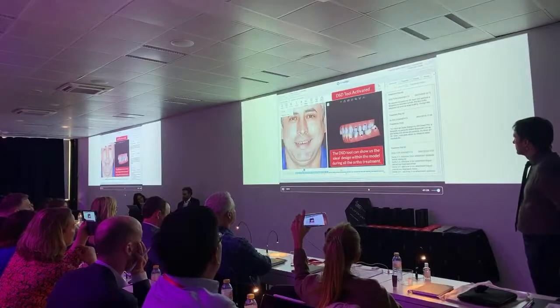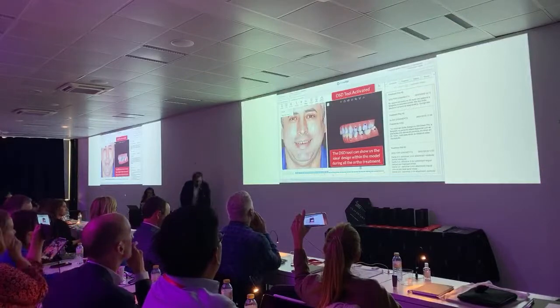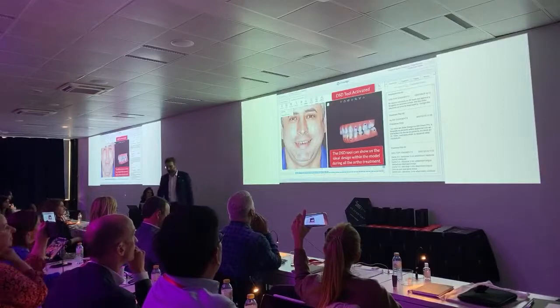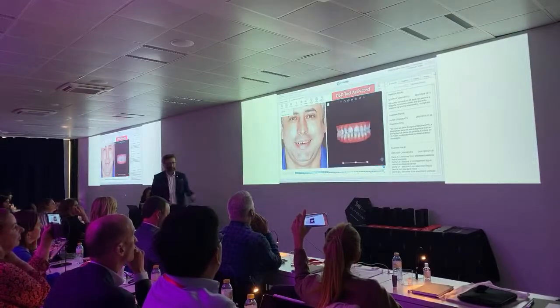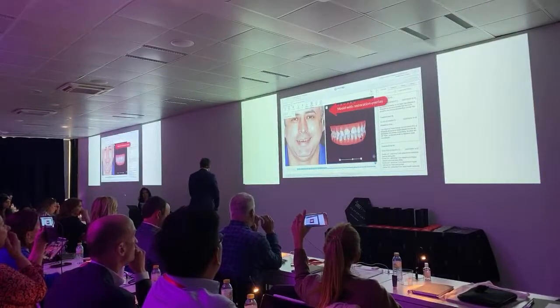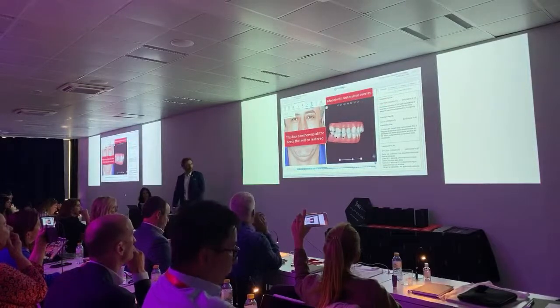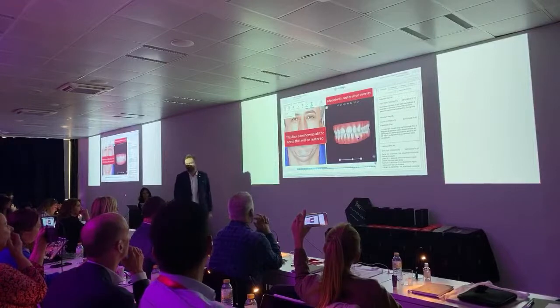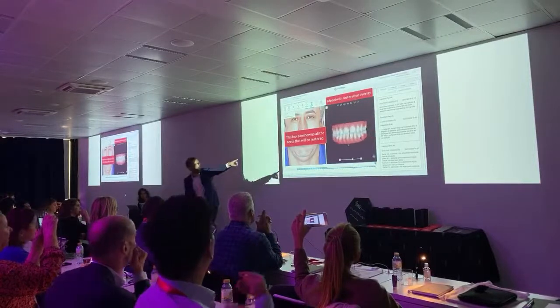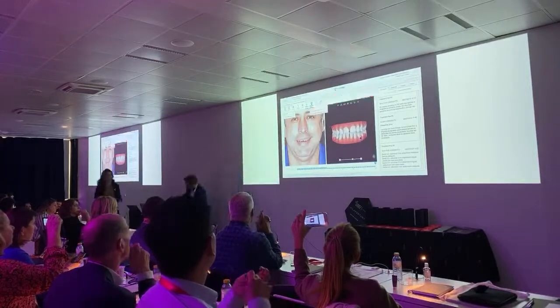We cannot imagine not having this anymore, and DSD and Invisalign will not exist if we don't have this anymore, right? So what I'm going to show you right now is just an intermediate thing that we're going to have to do until May. Since we were having the problems I mentioned to you, we detected some problems in the alignment between the light blue model and the teeth of the patient.